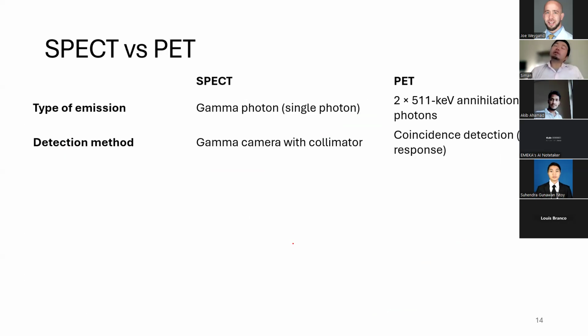So before we dive deeper into image-based dosimetry, let's review the imaging that we're doing, PET and SPECT. I did a quick overview in my last Reddit sessions, actually, so Joe can point you there. And I think some other people have also done quite a bit, so there are a lot of resources in the Global Medical Physics community.